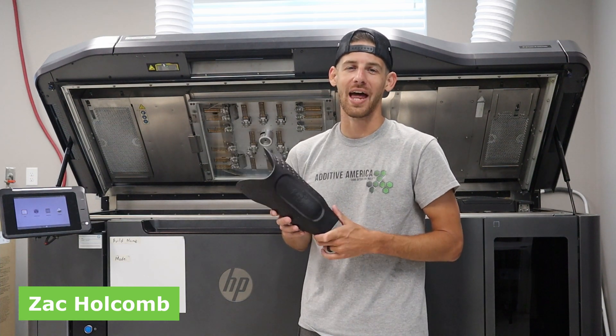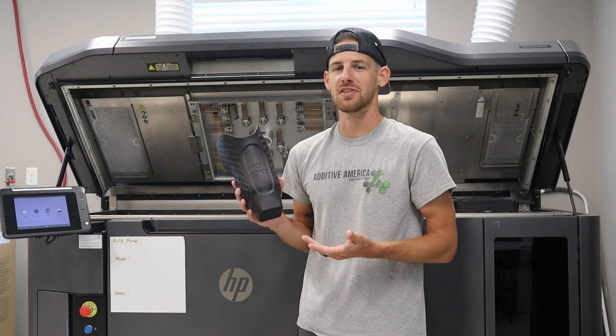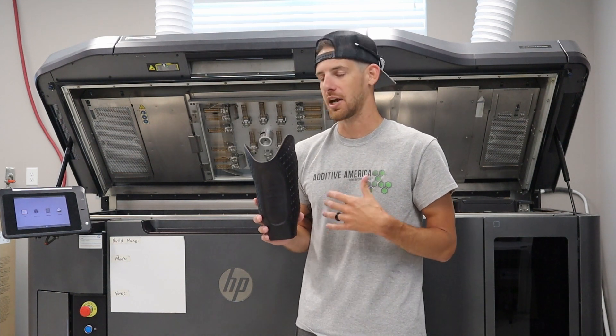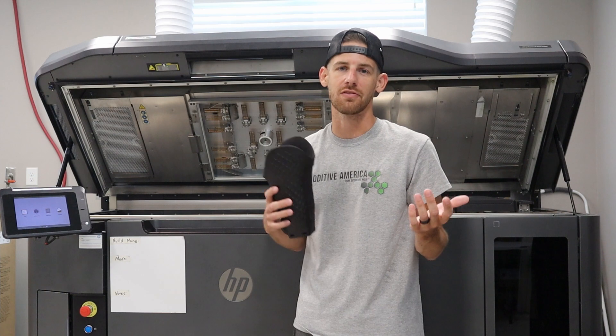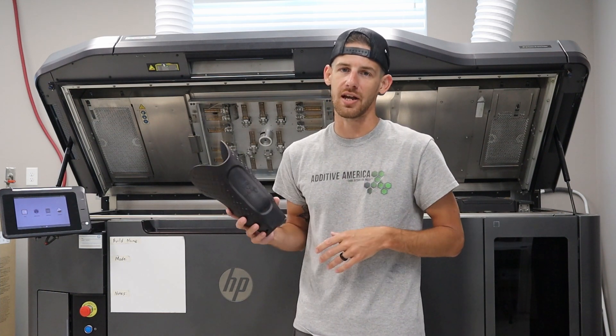What's going on everyone? My name is Zach Holcomb with Additive America, and today I'm here to show you our demo prosthesis. This is a transtibial socket that we've had printed and designed in-house, just to show off some of the different features and things that are attainable when utilizing additive manufacturing for your digital workflow and going down that path with your practice and your patient care.